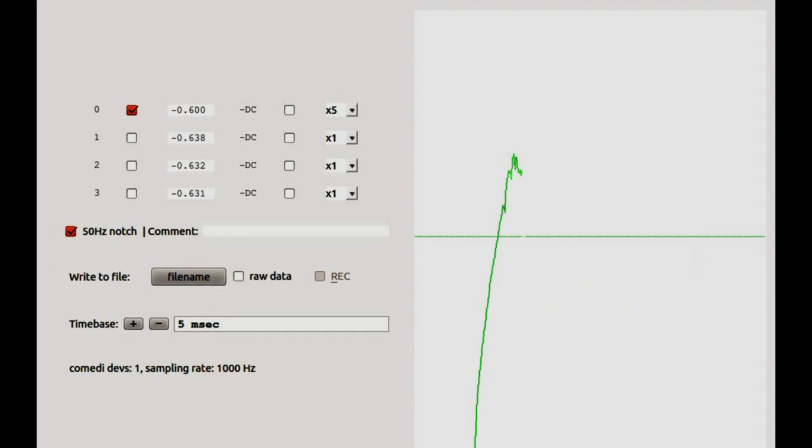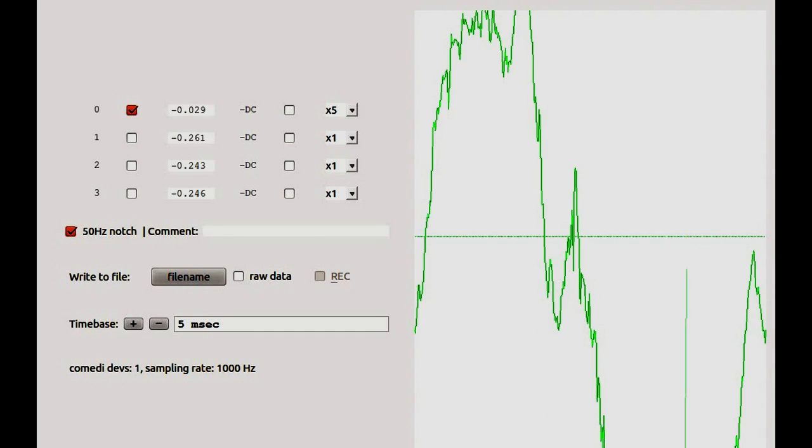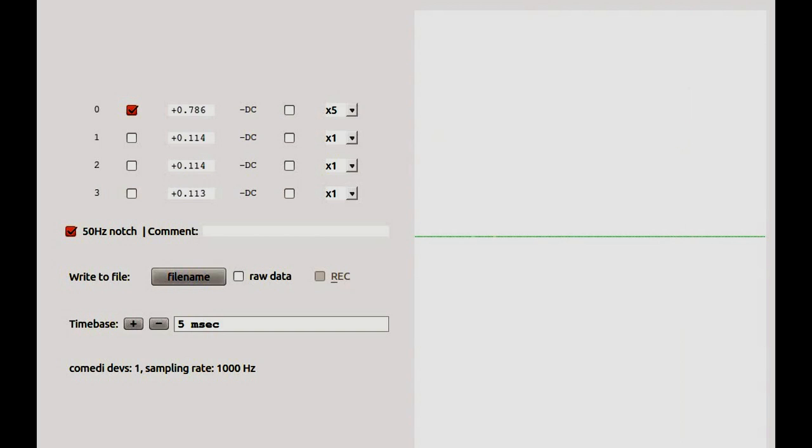Can I measure some other movement, say? Move my head and see what that does. Yeah, if you move your head from side to side, we're getting movement of the electrode leads. And our bioamplifier, it's a differential amplifier, as you said before.